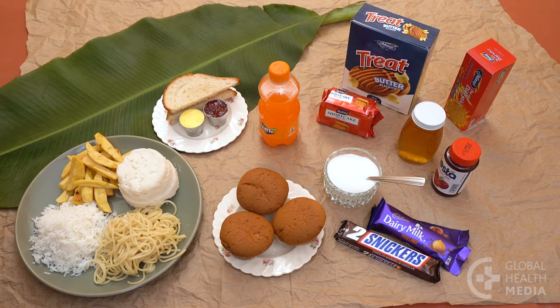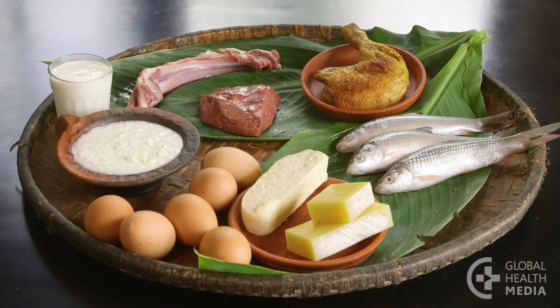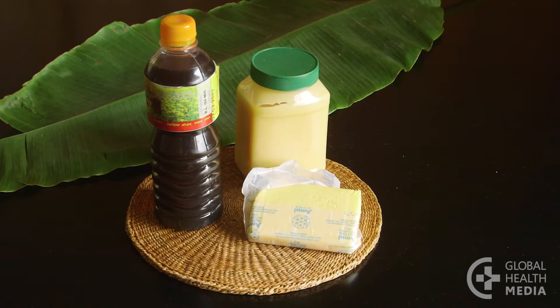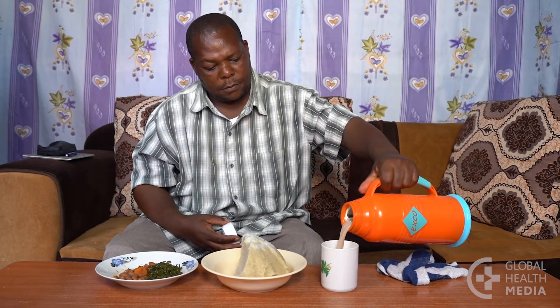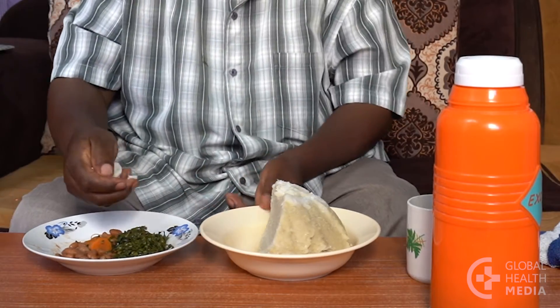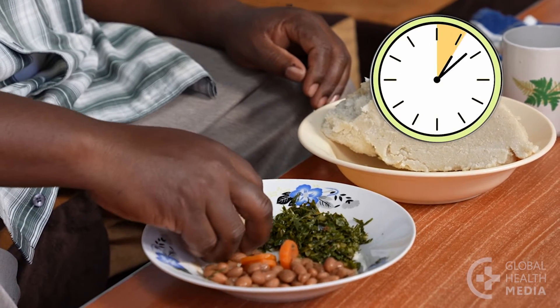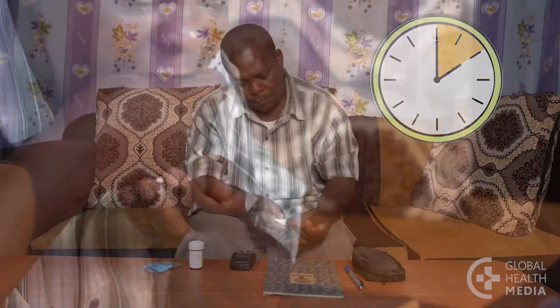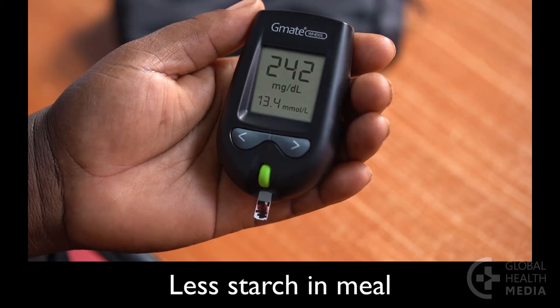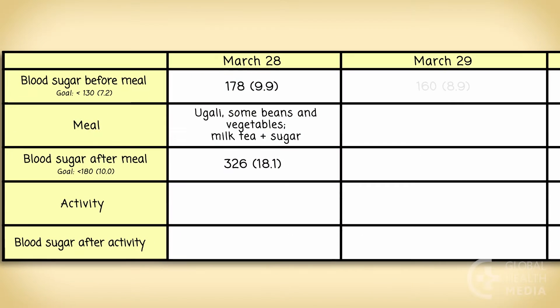Most people find that all starches and sugars raise their blood sugar levels much more than protein foods and fats. Now make a healthier meal by eliminating sugary drinks, reducing the amount of starch, and increasing protein foods and vegetables. Two hours after you start to eat, measure your blood sugar. That healthier meal made a difference but is still not at the goal. Again, record the details.